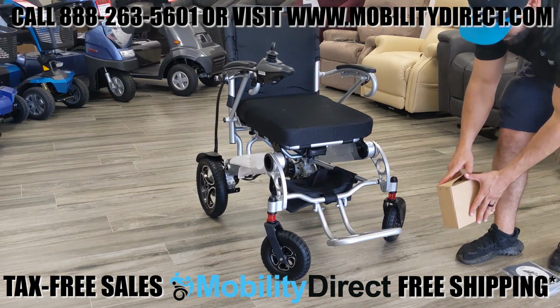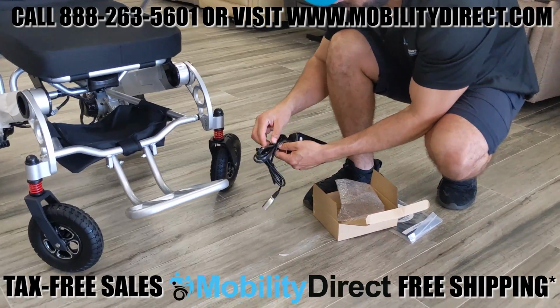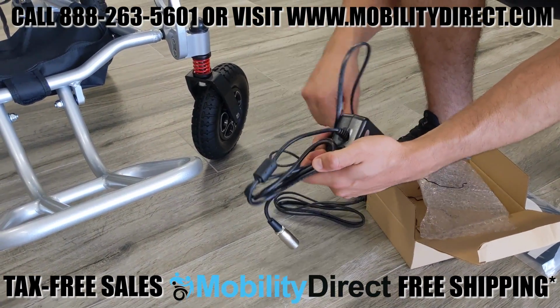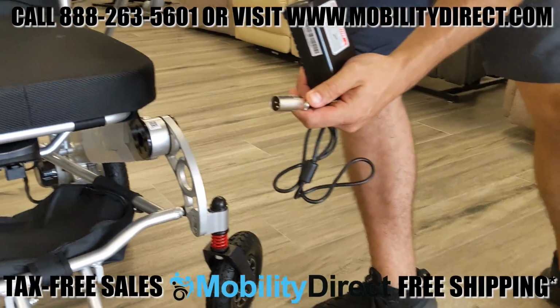charge your unit. When you first get your power wheelchair, you should charge it for at least 4 hours to train the battery. Since it's been sitting in a warehouse for a while and not getting charged, the best practice is to go ahead and charge it up for at least 4 hours. And you always want to keep it topped off. Don't let the battery fall too far down.